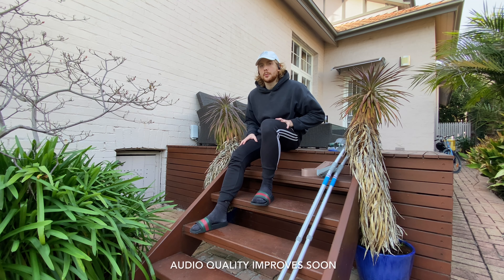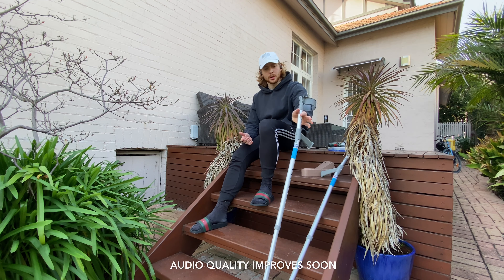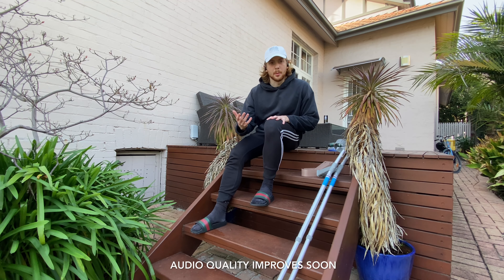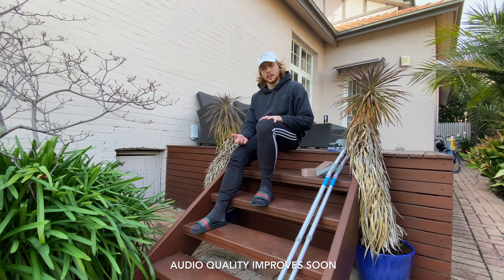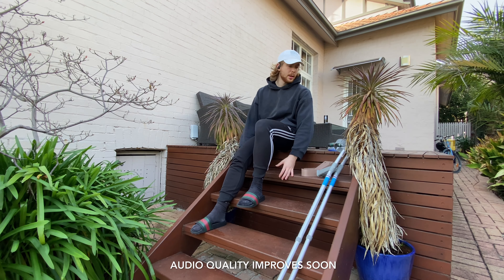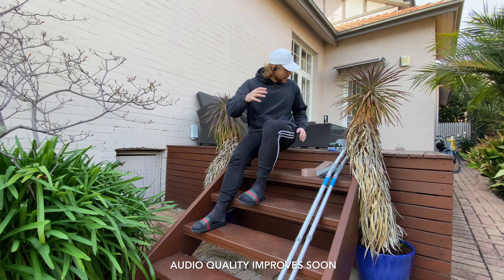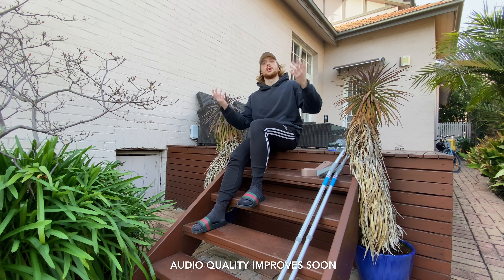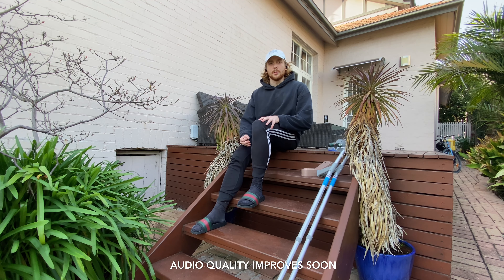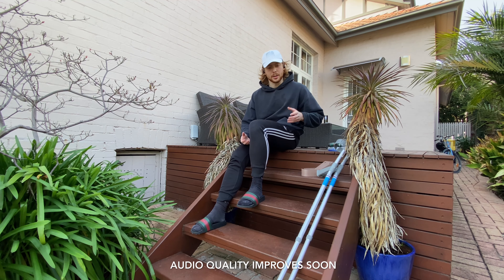For the last three years I've looked at my father who has, throughout that time, had to rely on using crutches to get around due to injury. Over this time I've observed and listened to his struggles with outdoor steps such as these. The lack of handrails, combined with moisture from the elements being outdoors, create a difficult area for him to traverse with his crutches, particularly when descending.